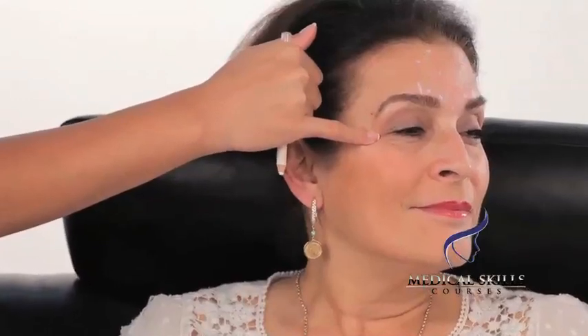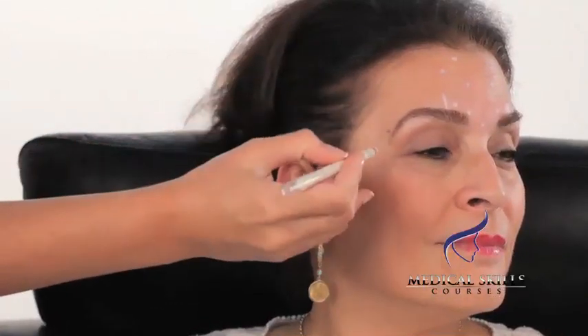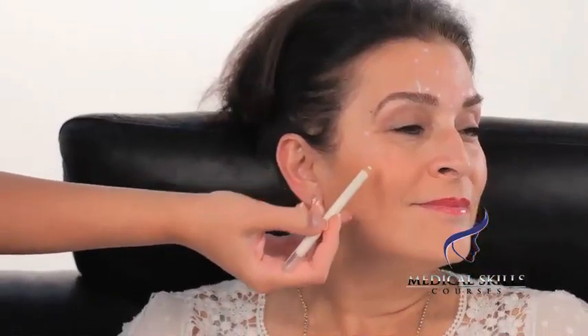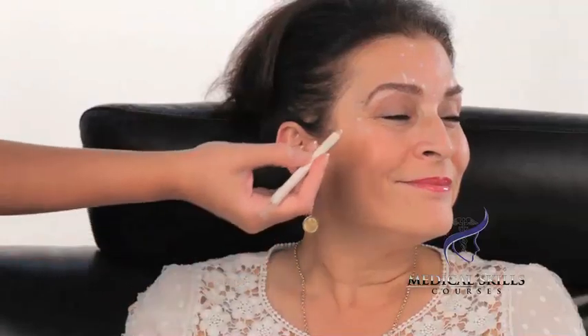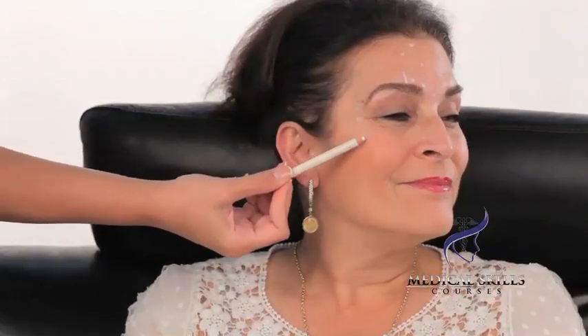We're now going to mark the periorbital area. Again, we're going to ask the patient to contract — would you kindly smile for me and keep holding that smile? The first injection is in line with the lateral canthus of the eye, one fingertip — about a centimeter — away from the orbit. If you imagine a triangle coming out from around the orbit, you can get a feel for the crow's feet and see the borders. The upper and lower injections will be at the top and bottom of this border. So we'll put one injection just there and one just here — three injections in total.